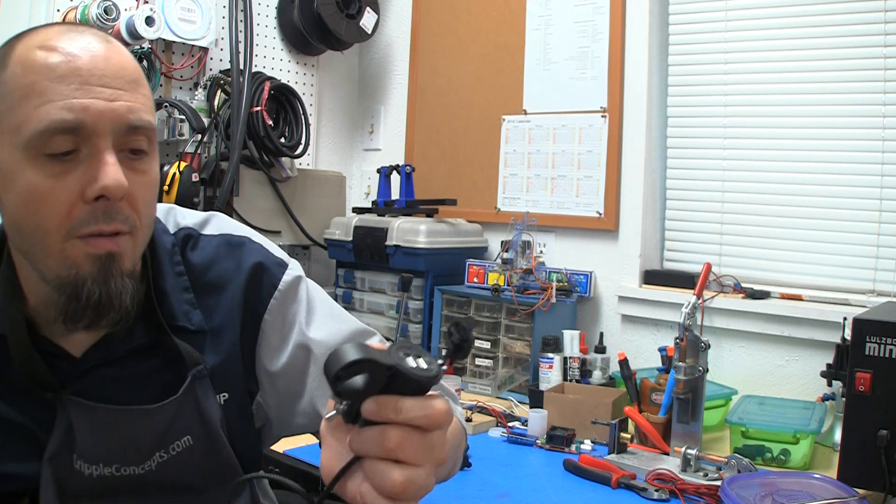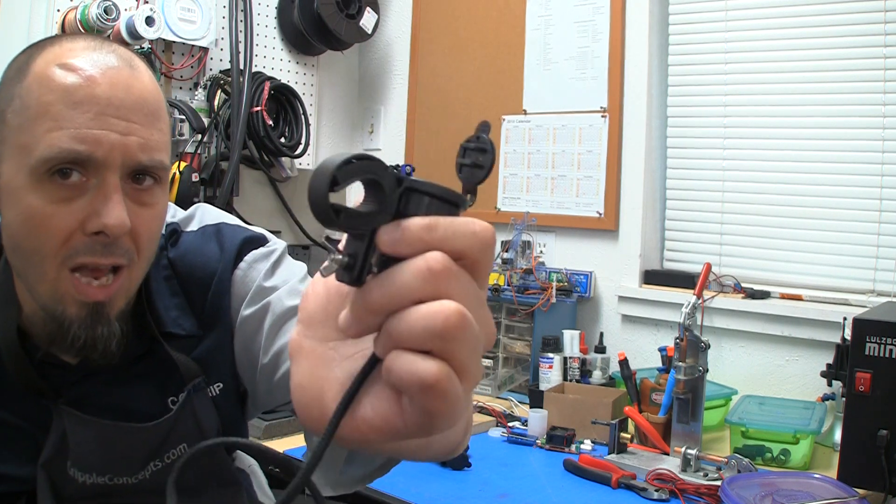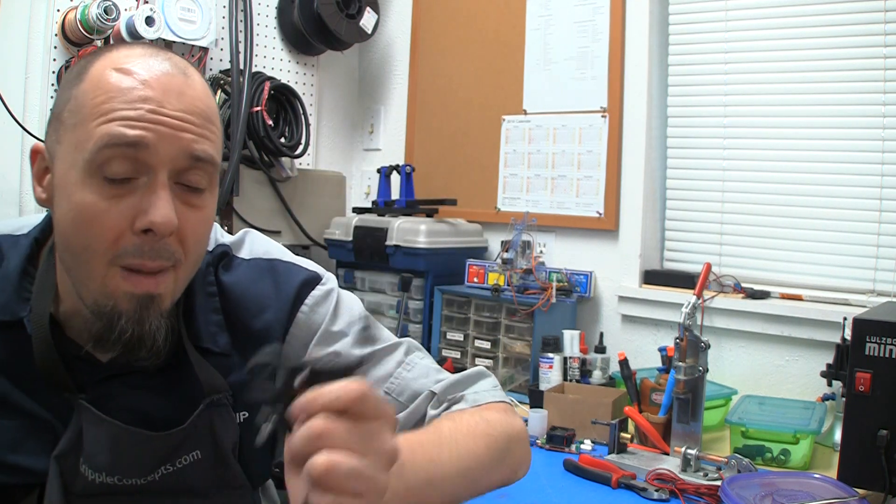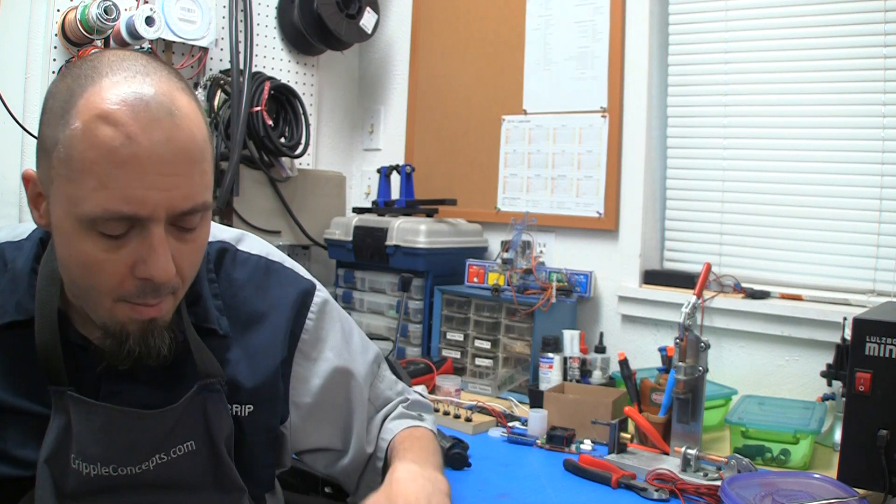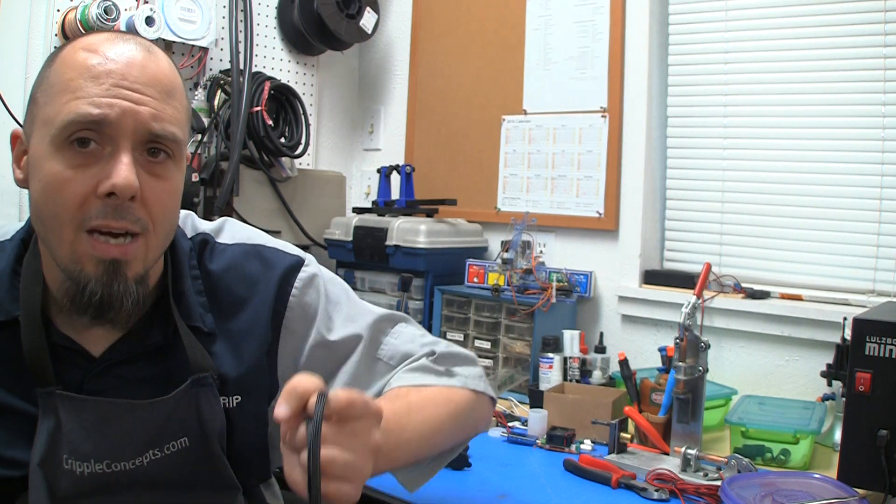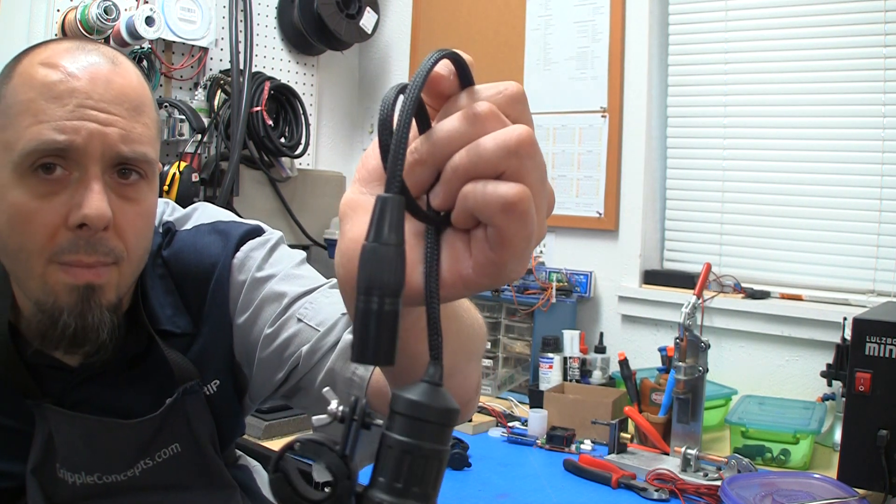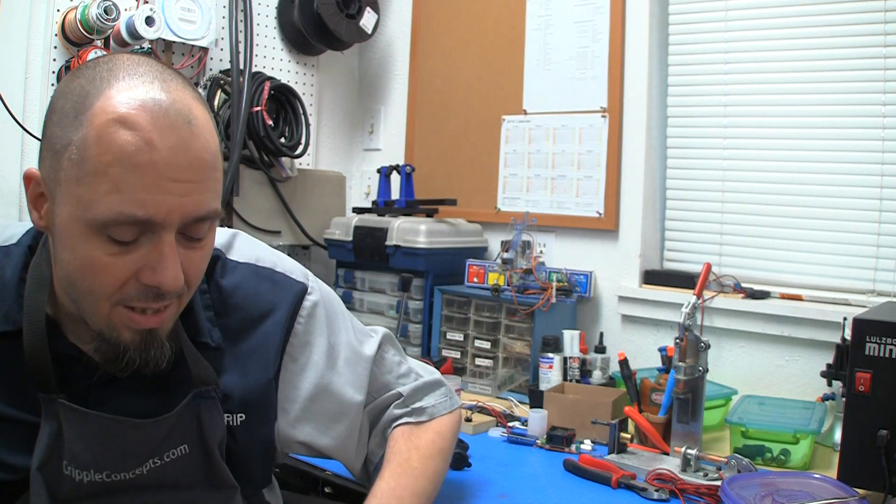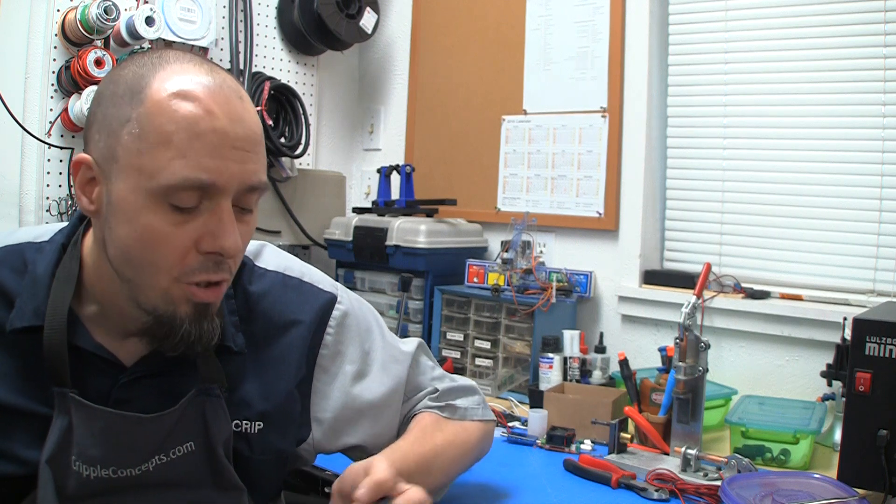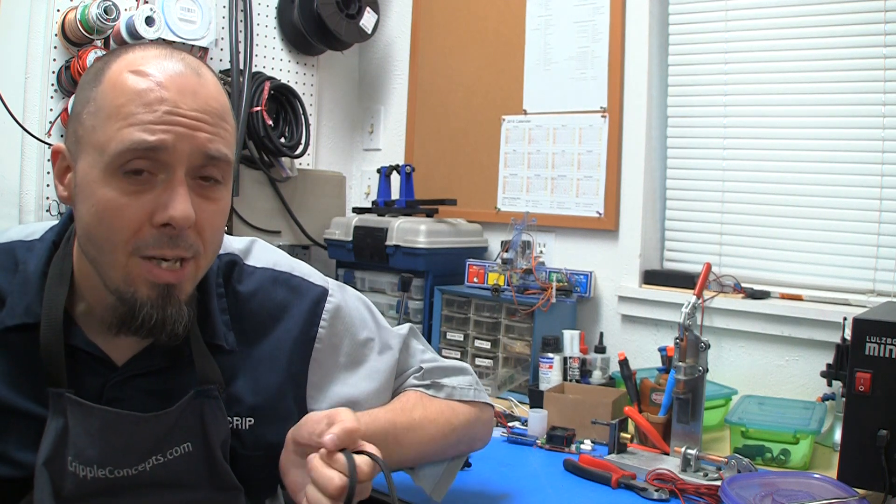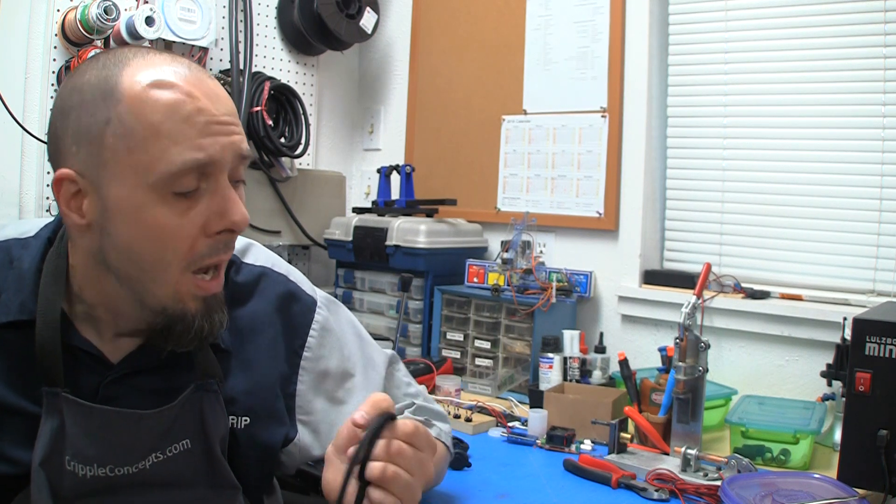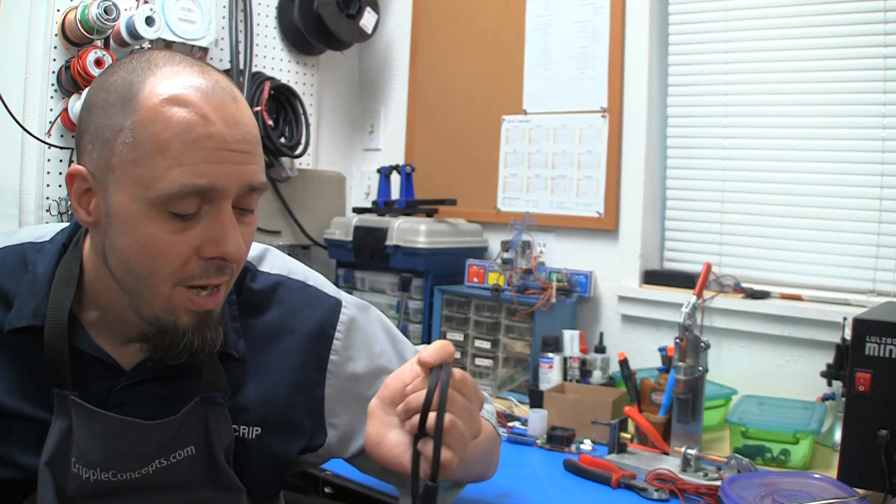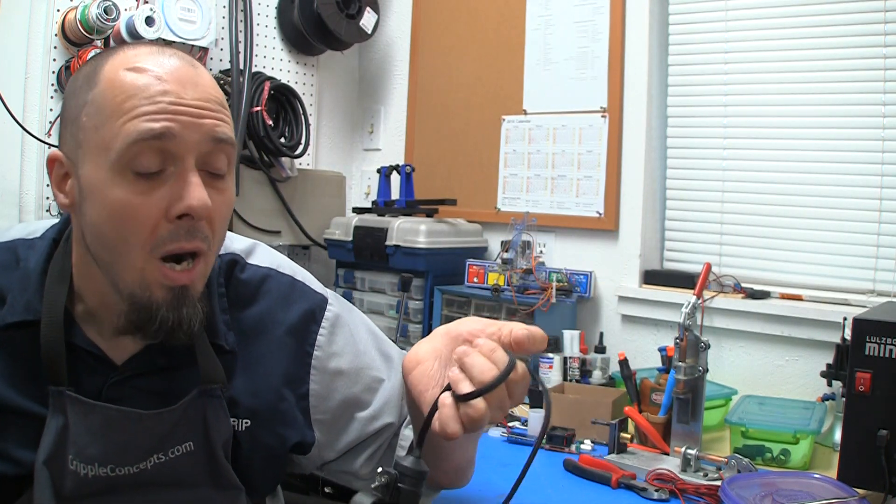Now these things are a little different than the other ones on the market. You see this clamp, it's a little wing nut. These are made to mount on your chair somewhere, mounted to an armrest, footrest, frame of your chair, wherever. But then on the other end, you still have the standard XLR plug. For a long time, they only made the straight plug. It does look like they now make a 90 degree option like we do for our turbochargers. But I believe they're only clocked in one direction, which works for the majority of the chairs.